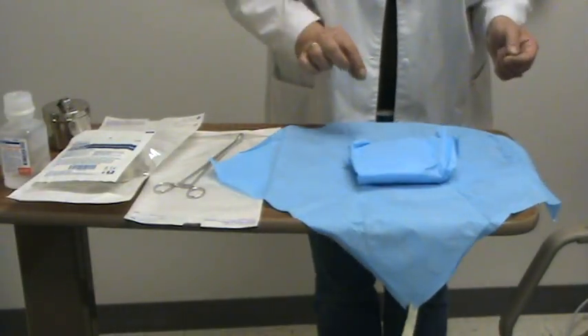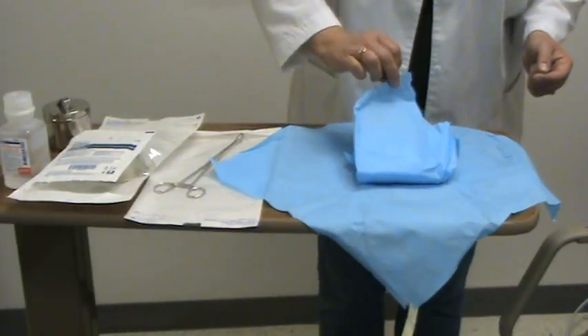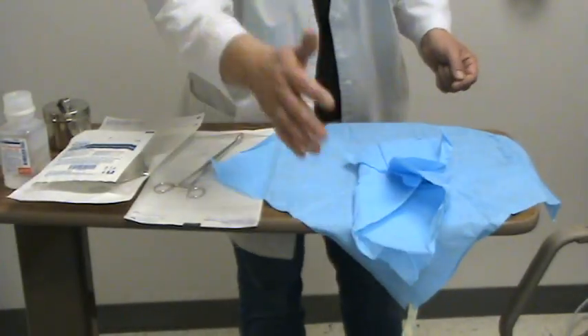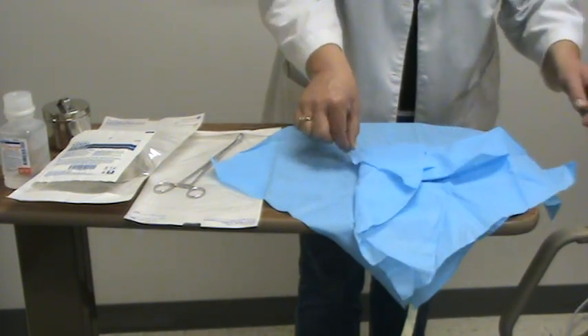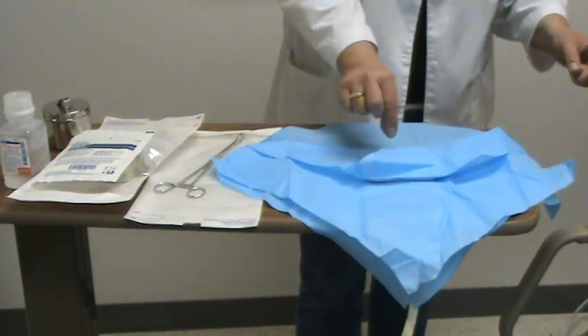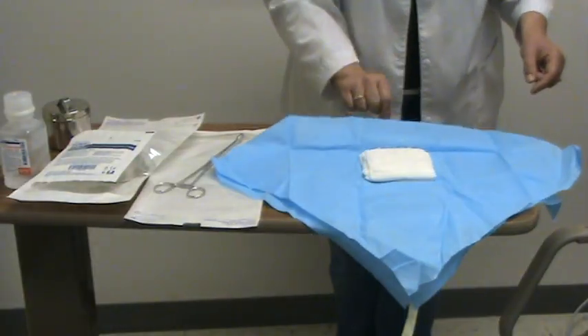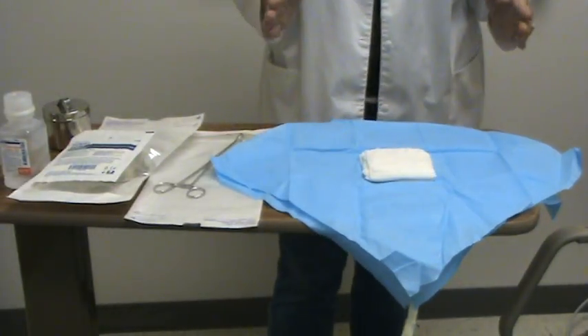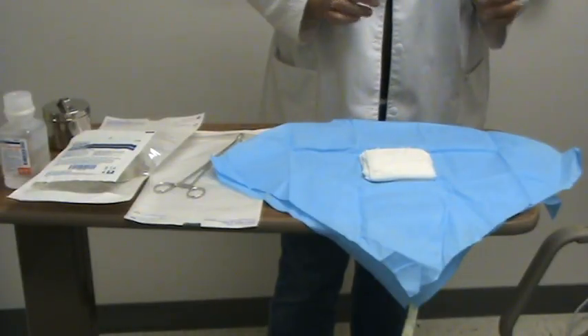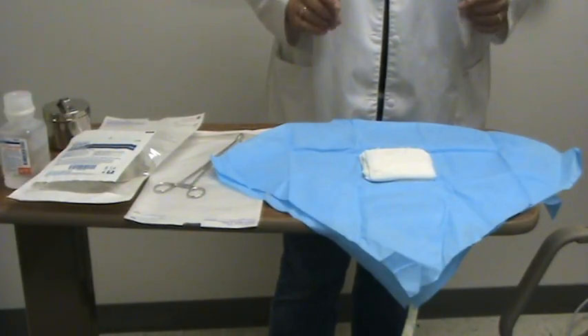Do the same for the inner package. Take your tab and try not to work over the field at all. Bring the little wings out — the last one always comes towards you. Remember where the border is: that 1 inch inward is sterile, 1 inch outward is not sterile.